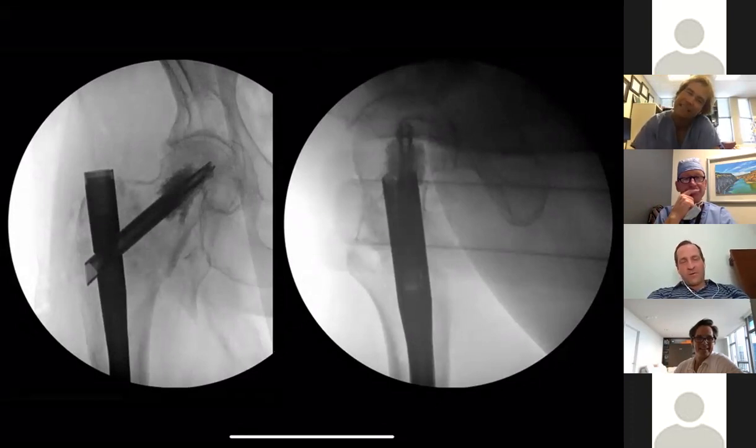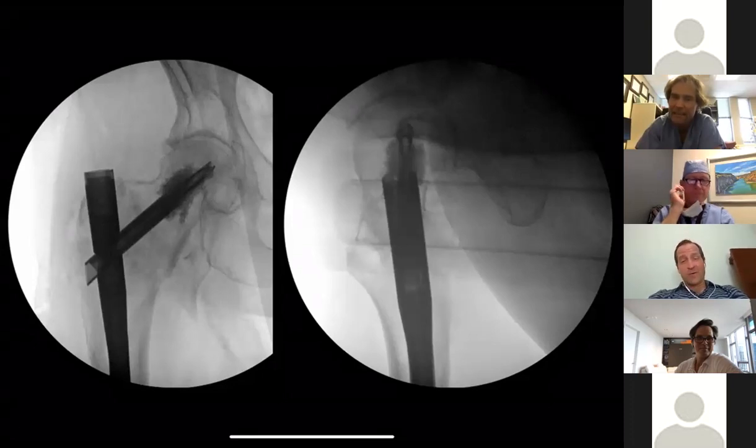It's not perfectly correct. When you have this lateral translation of the shaft, doing what Sean mentioned, which I do frequently, is come over the top with a hook and try to pull in the neck. Sure. You get more varus that way. It's a little bit of a paradox. And if you push on the shaft, the only way it's going to stay there is if you put in a blocking screw. How many of you are using blocking screws in 80-year-olds? Nope. Yeah, no, that's not happening.